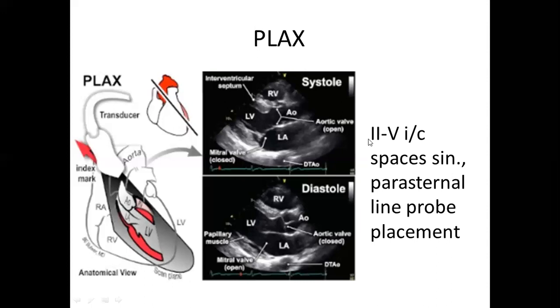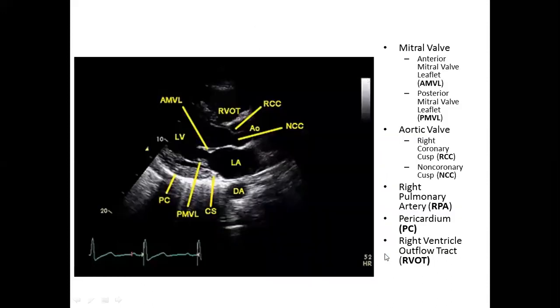So how you will place the probe, ultrasonic probe, from second up to fifth, it depends on the level, intercostal space on the left side on parasternal line. And this is how B mode picture is going to look like with bigger explanation. So you can see a few additional structures right there, which are important to identify for the practical doctors.